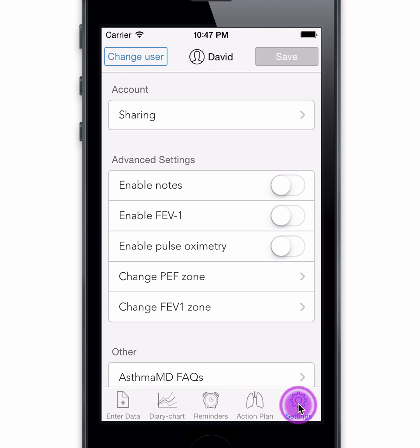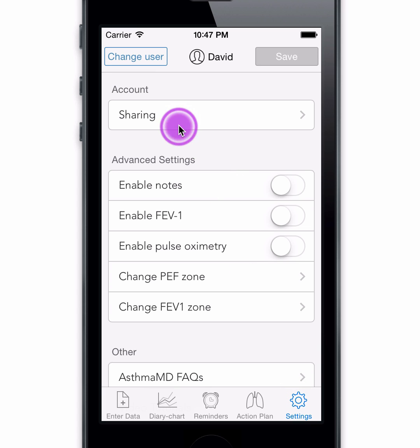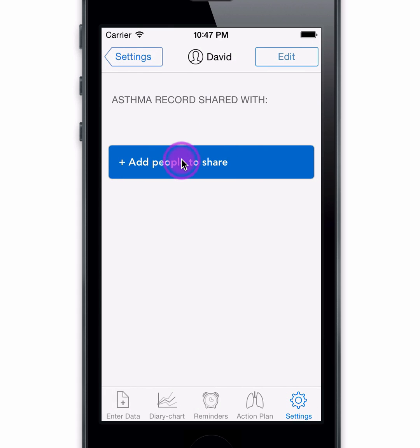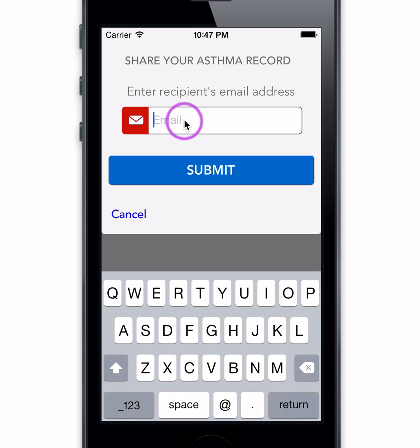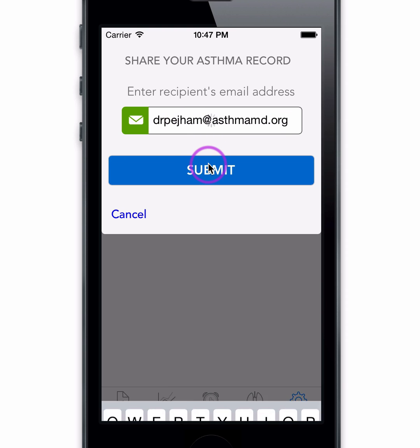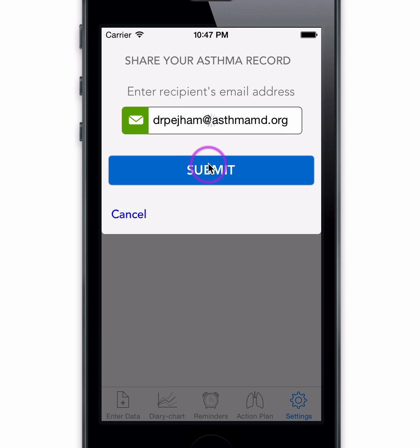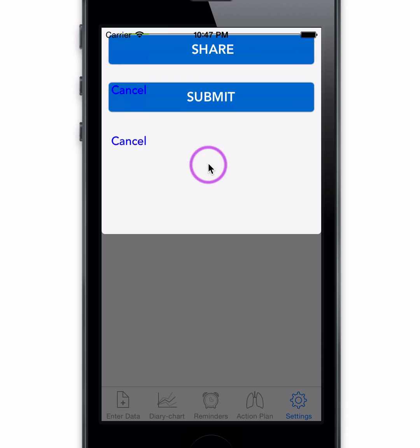To further customize AsthmaMD, visit the settings page. Sharing allows remote monitoring of your asthma data. This will give continuous access to your asthma data by your selected recipient via the MyAsthmaMD secure portal.